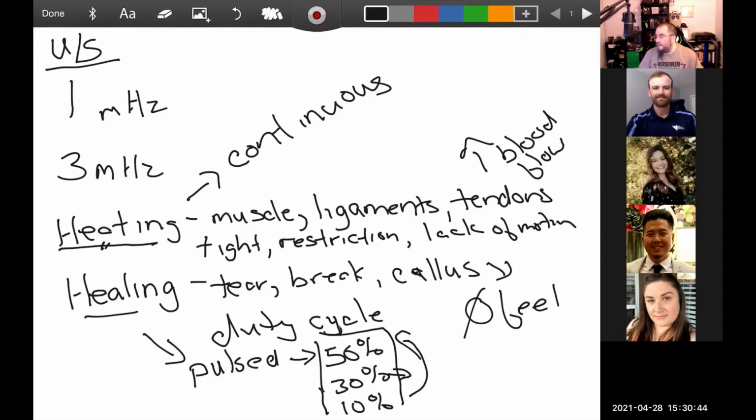John, what was your question? Yeah, so on the pulse on that one as well, would we ever use maybe like 60% to 90%, or would we just go straight to continuous if that's the case? I mean, I guess you could. I don't think I've ever. I'm going to be honest, in my clinical experience, I don't think I've ever used anything over 50.